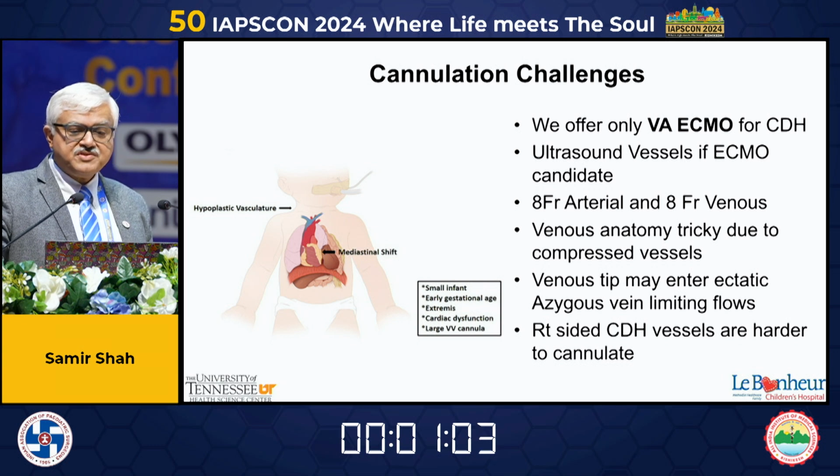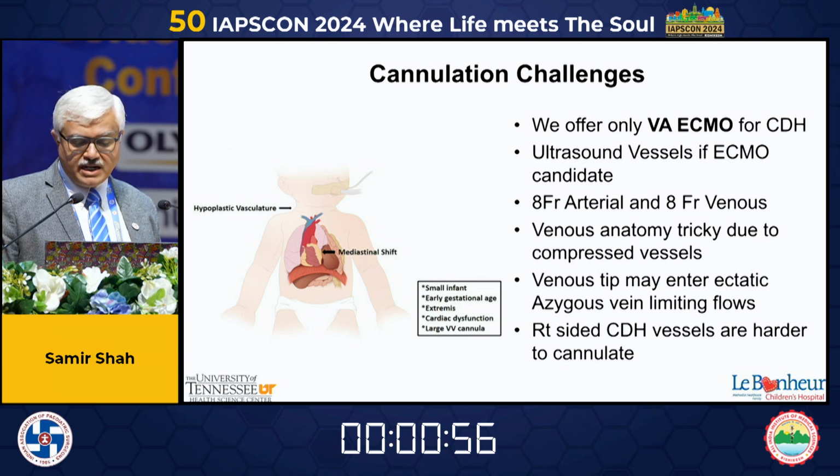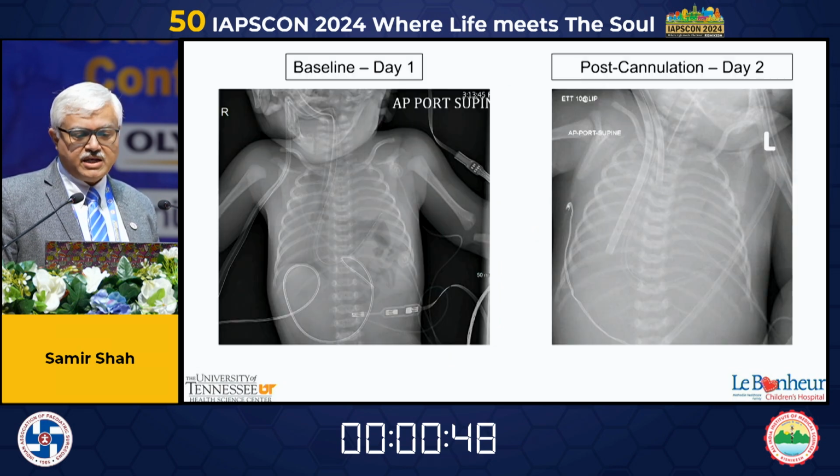But even on the left side, when you put your cannula, the tip may actually enter into the ectatic azygous vein. We use these kind of ECMO cannula that I mentioned to you about. They are 8 French cannula.